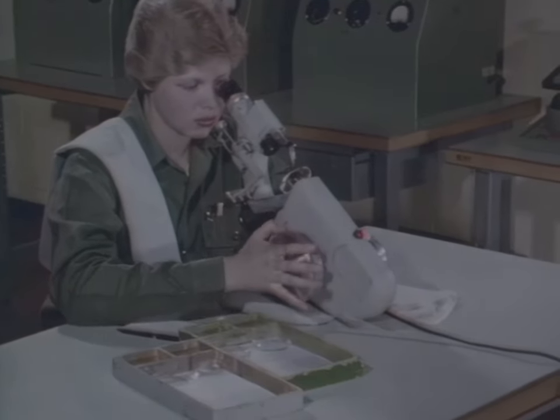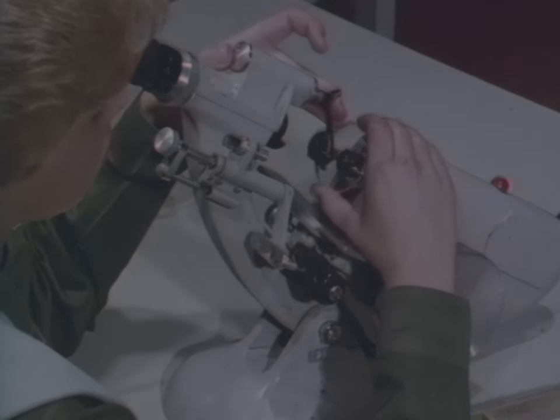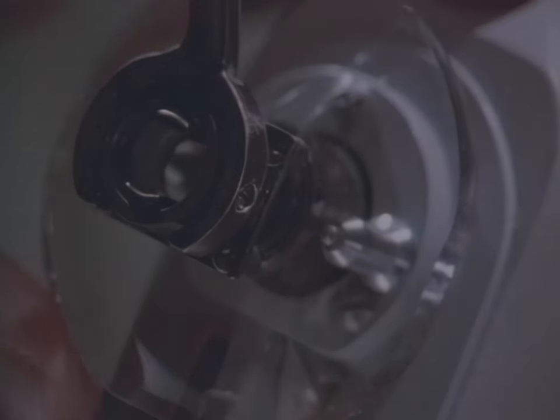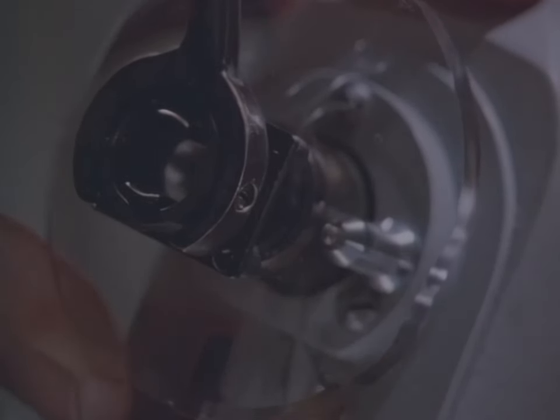You already know how to neutralize spherical lenses. You've seen how the target lines come into focus as you adjust the power wheel. But with cylindrical lenses, there's an important difference. Because the lens has two different powers ground into it, the two sets of target lines come into focus at different power wheel settings.